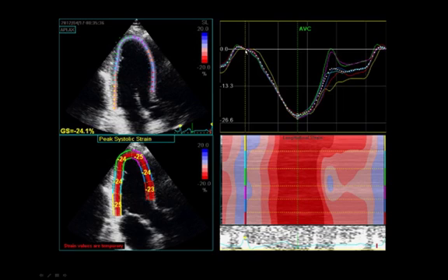And just like I showed, this is the representation of going from 0 at the aortic valve opening, shortening very quickly to the peak. This is obviously a very normal individual. And then in the untwist, you see the de-lengthening. You see how the represented apex, green and purple, go quickly and fast back to 0, as opposed to the other segments that lag. So it's very much showing a distinct lengthening and unlengthening of the apex separate from the rest of the heart.